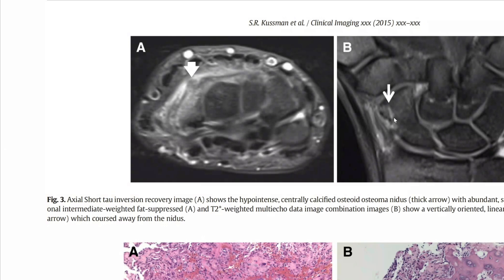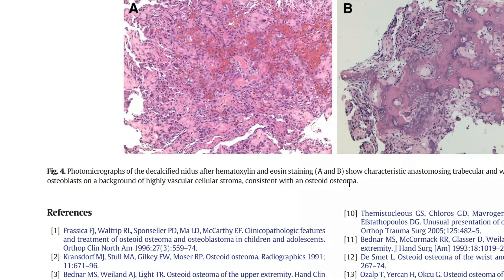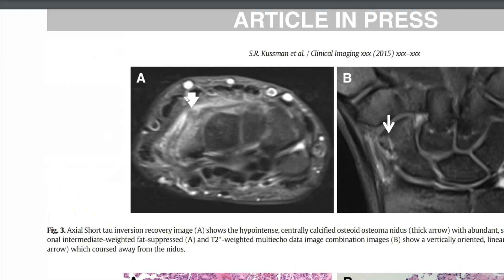This is what they refer to as the vessel sign — and this was an osteoid osteoma. I'm not sure how well we can separate osteoid osteoma from something like a mechanical hypertrophy. I wonder how easy this is actually to separate. So I've added osteoid osteoma as a differential in my report now. I hadn't finished the report — I did the video first — but I now have it in my report.